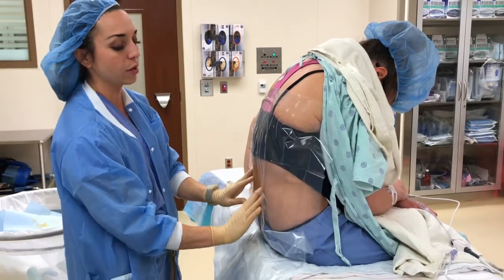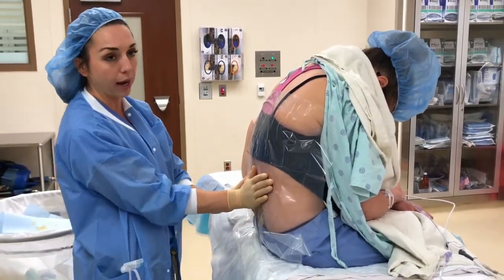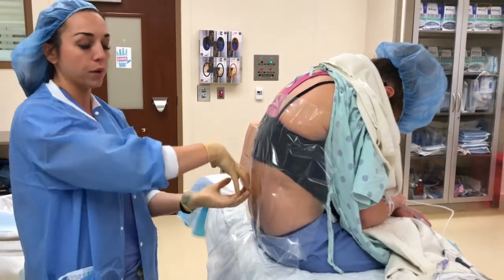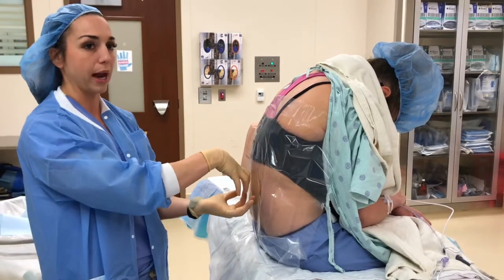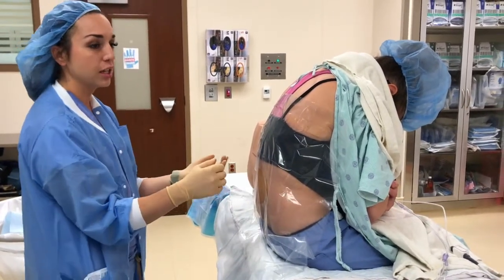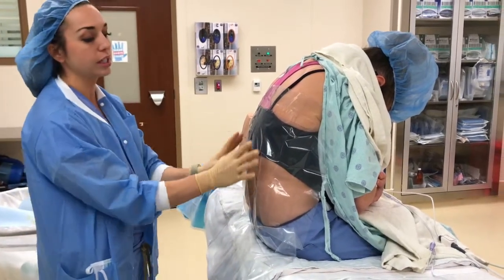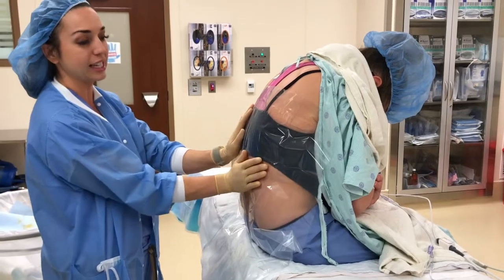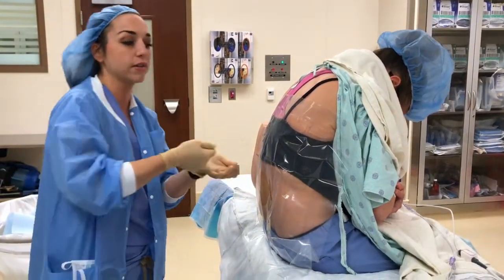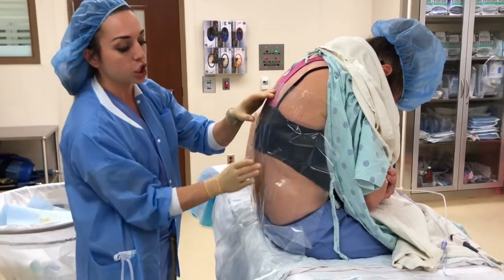And many times we'll tell them it's kind of like an angry cat, and to try to focus on putting the lower part of their back out towards us. And to imagine trying to open up the bones in their back is sometimes what I'll tell them. Sometimes they'll have the inclination to do this or that, and so it's important to tell them to try to keep this part as flat as they can, because a lot of them will think when you tell them to hunch over that they're going to lean forward as well, and that's obviously going to affect the angulation of your needle. So just focusing on a good C shape.